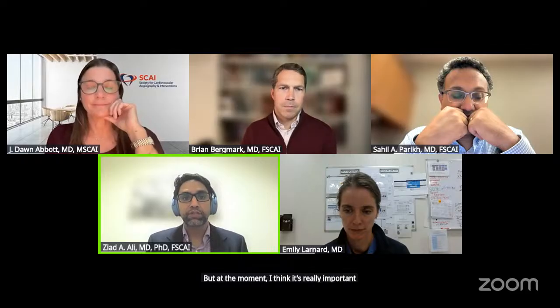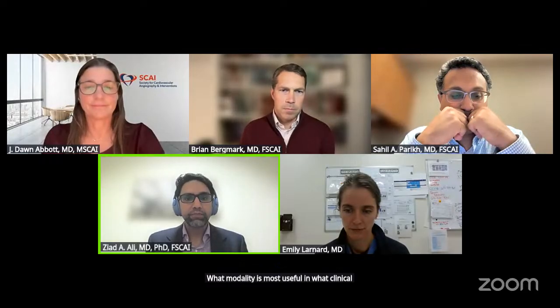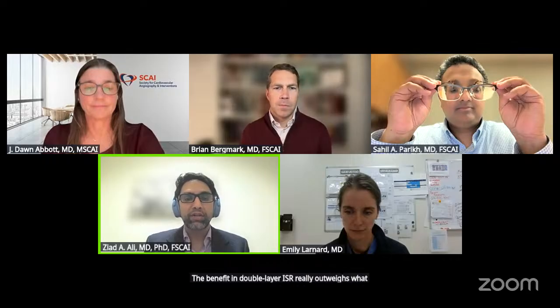But at the moment, I think it's really important for us to acknowledge what modality is most useful in what clinical situation. And so clearly this recent publication by Ajay and the group from Agent shows the benefit in double layer ISR really outweighs what happens in single layer ISR.